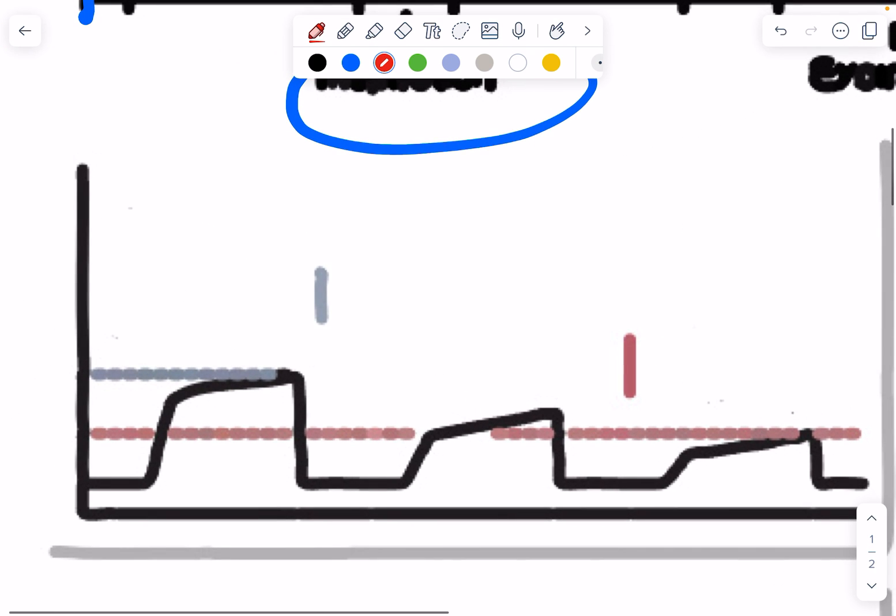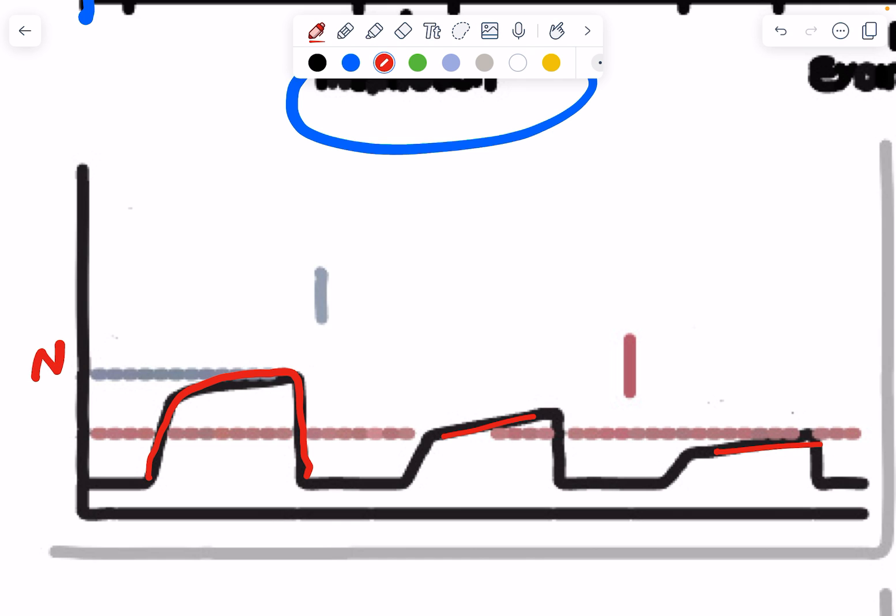Look at this. Number one, I have a really high waveform, as you can see, as compared with the remaining ones. This is, by the way, the normal range, shown in gray. So initially, the patient has exhaled so much CO2. And then later, you can see that their end tidal CO2 is at a lower level, and it's getting lower with time. The baseline is actually going down. So instead of 35, maybe this is 30 or something. What's happened is that this patient is breathing out faster than he should. This is called hyperventilation.